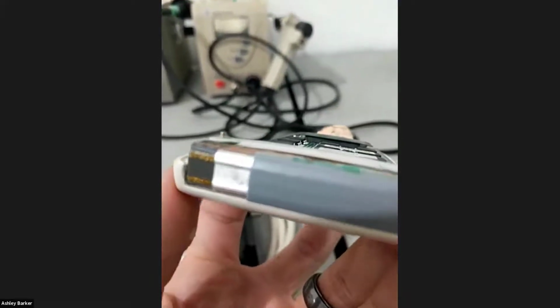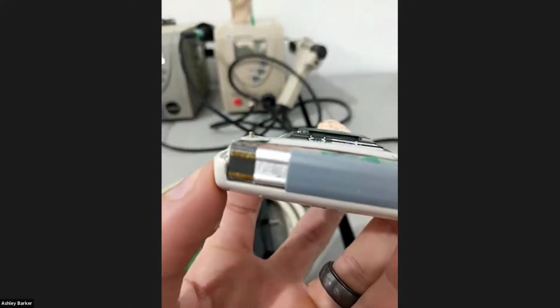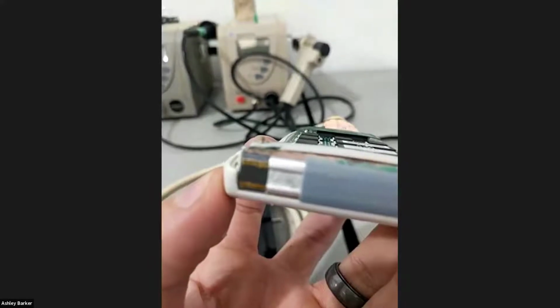I don't know if the phone is good enough that you can see the individual crystals there, but with your eye, you can actually see individual crystals. It's a little blurry, but you can get an impression. You can sort of see it.